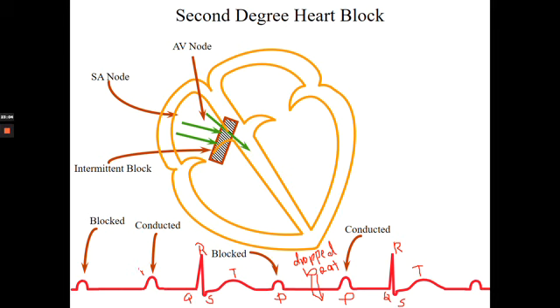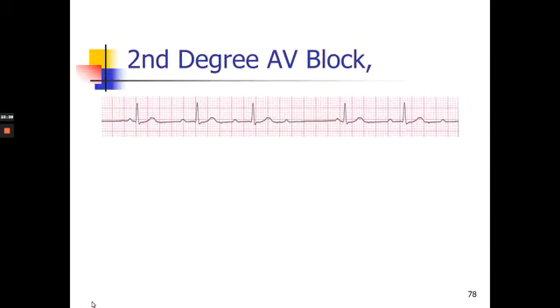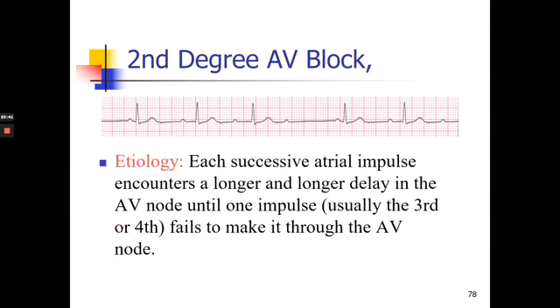This is blocked, this is conducted. This is here a dropped beat also. Dropped beat. Okay? This is second degree heart block.